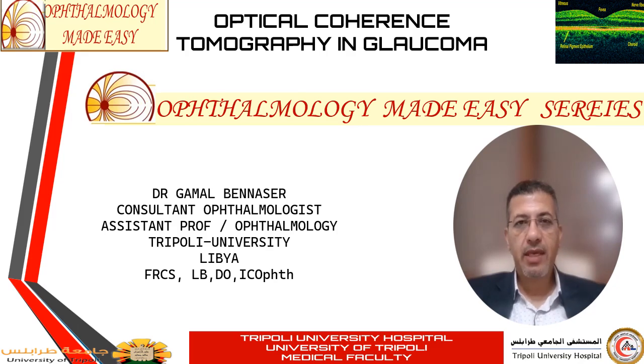We will start with a simple introduction of the principle of OCT and the evolution in the technology of OCT, from the time domain to the spectral domain, and then swept source OCT. And finally, we will speak about the development of OCT angio. We will discuss all these issues related to glaucoma, how we can interpret and follow patients with glaucoma using this technology. And at the end, we will discuss establishing a progression analysis for glaucoma patients.